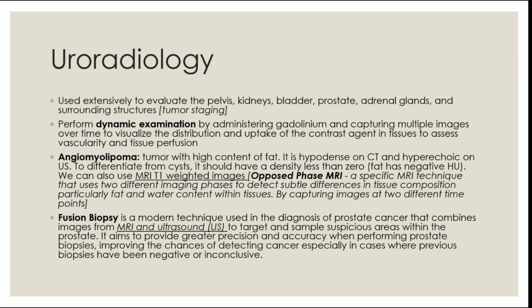Fusion biopsy was not mentioned in your lectures, but I think maybe it's interesting to know. In the urology department, they were using a technique where they combine ultrasound and MRI for the diagnosis of prostate cancer. They were taking samples, the biopsies, using both the ultrasound and the MRI for better visualization of the mass, so they can easily take it without having to repeat multiple biopsies. So that was interesting to see, the fusion biopsy.